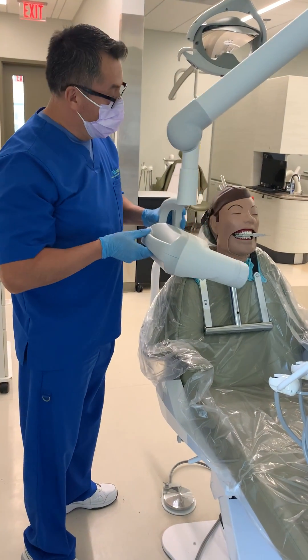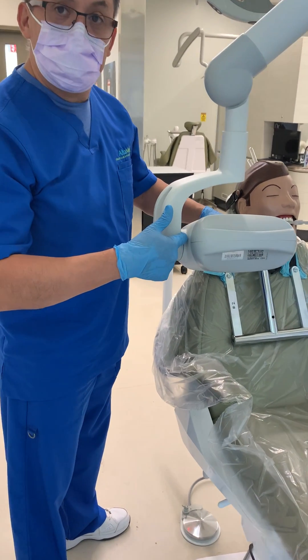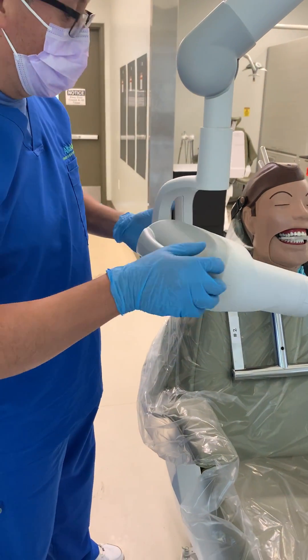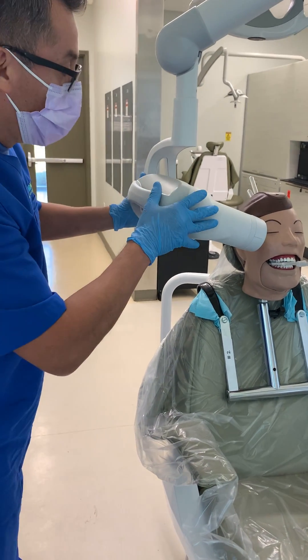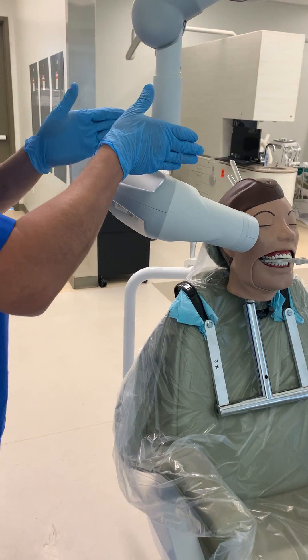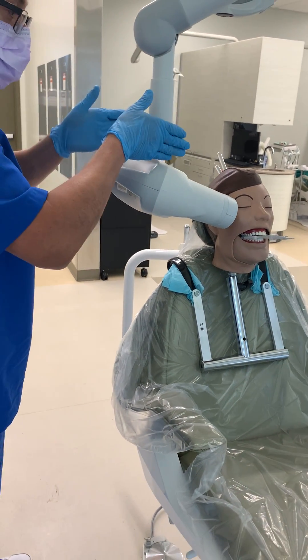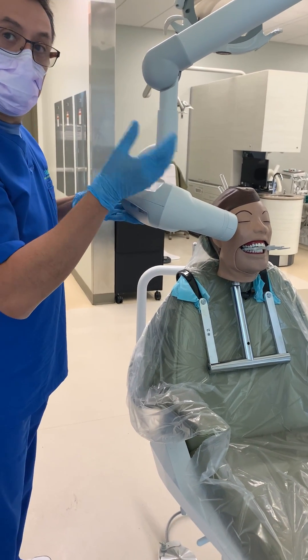I already placed back the film inside the patient's mouth. As a recap, we have 20 degrees set right here on the PID for the extra unit. Now, step number one: you don't want to hold the PID straight against the teeth like that because our teeth curve, and if you do this, you're going to get overlapping.